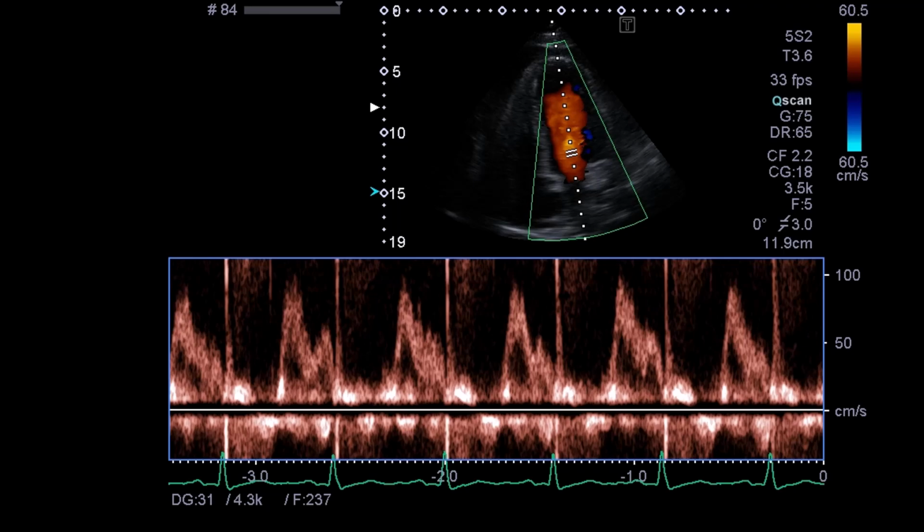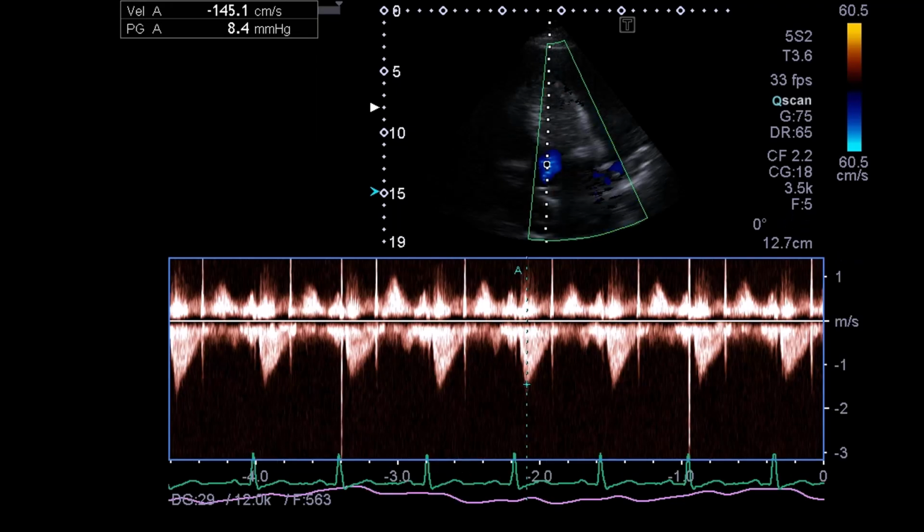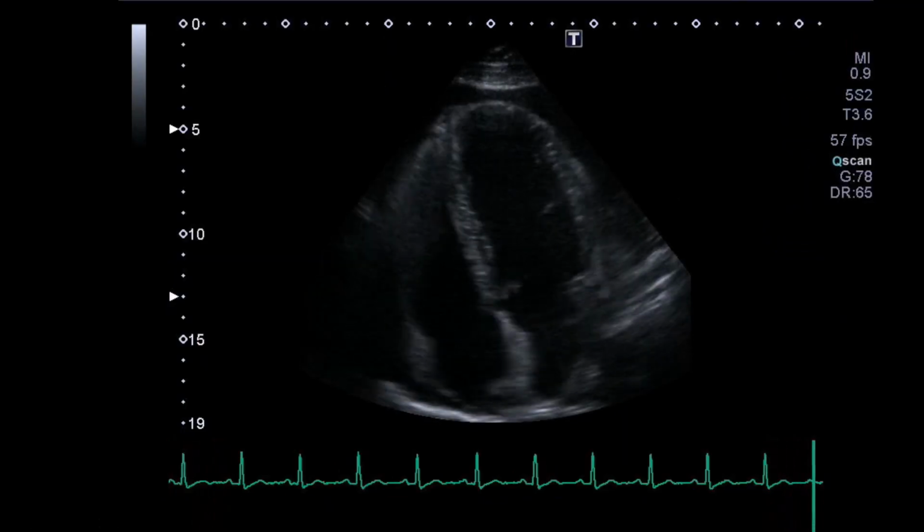The diastole itself doesn't appear to be significantly altered. We have a normal E to A ratio here with an okay E that isn't overshooting either, and the deceleration time is normal too. And even when we look at the LVOT, we see a certain variance here, yes, but it's not huge. So finally, let's go back to the four-chamber view, and now we've tried something else.